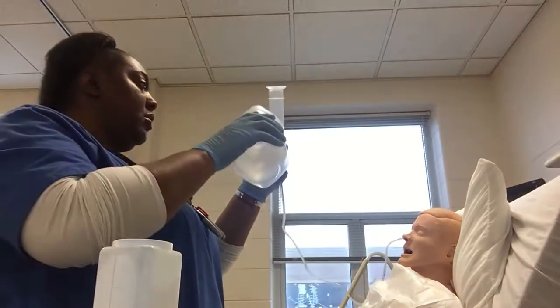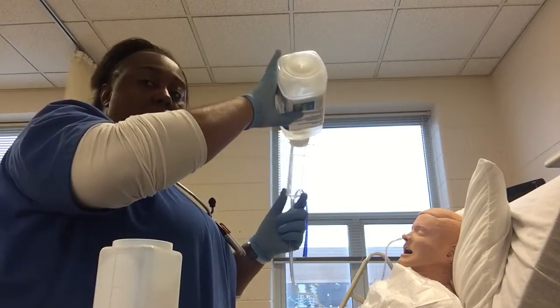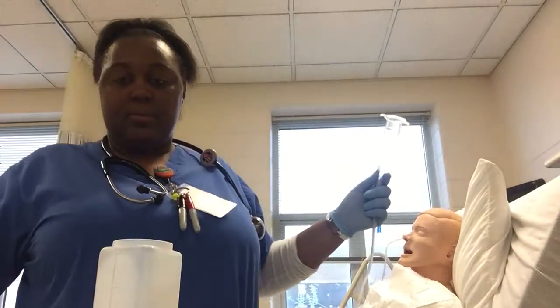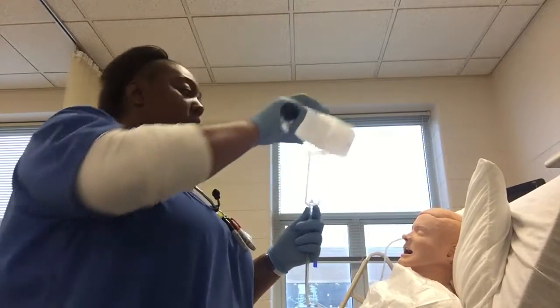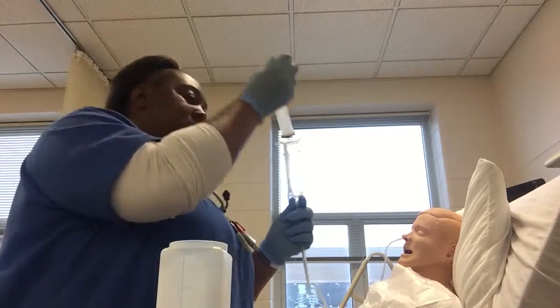And then once it goes down, I will put more in and let that slowly go down. And then I will ensure that before all of it is complete, I get 50 milliliters of water and pour it in here, so that way it's that flush.